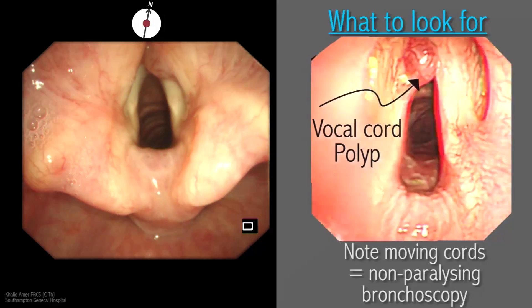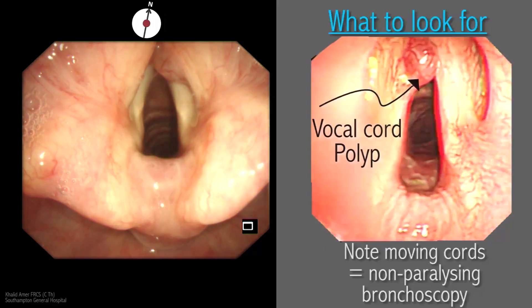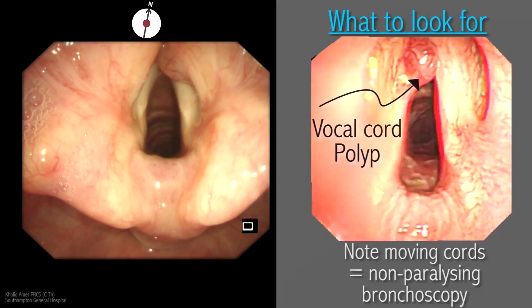Here is another example of a benign lesion — a vocal cord polyp — but a biopsy was taken by the ENT colleagues on this occasion.